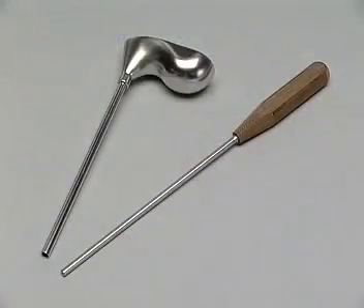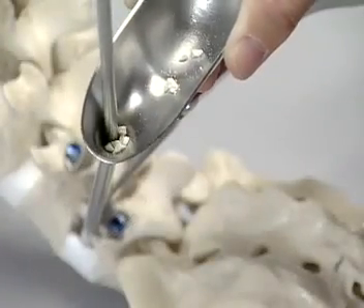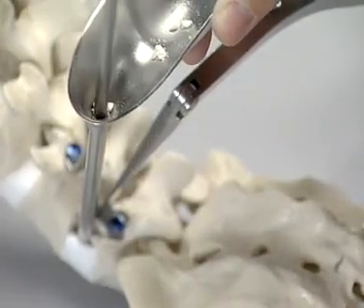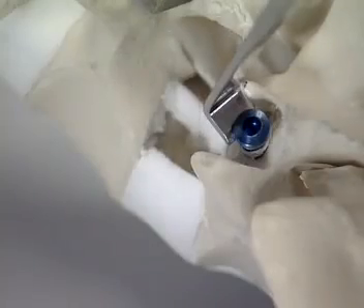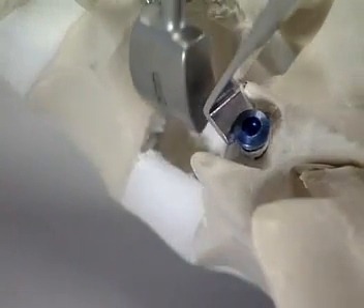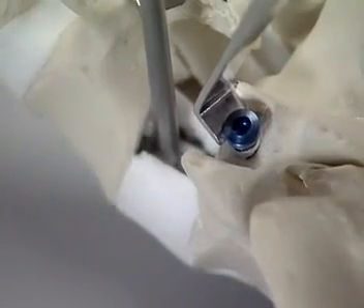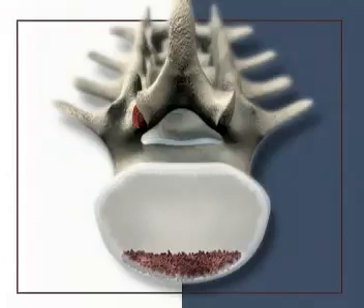In the clinic, a funnel for cancellous bone and the appropriate impactor are available. The funnel is introduced and the cancellous bone chips or bone substitute are pushed into the disc space using the impactor. For this exercise, tweezers are used. The trial implant may be used to position the cancellous bone chips, which form a bed for the cage.